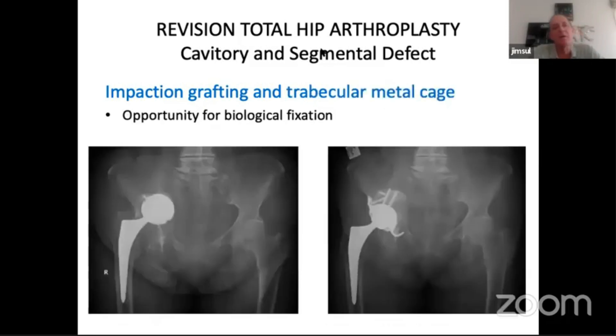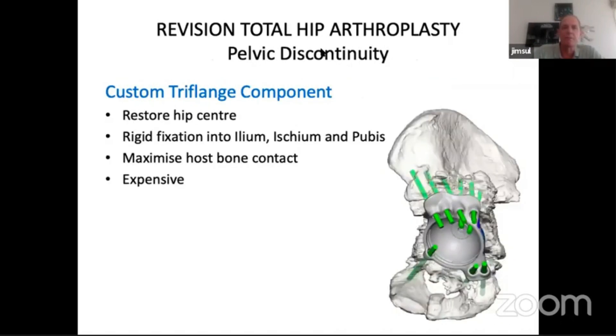This is a recent case — a patient who had an anterior approach total hip and unfortunately the cup was punched right through. In this case we used a biological fixation cage with structural allograft, and the patient, despite the degree of osteopenia, has done well at three years. If you've got pelvic discontinuity, really the best option is to go for a custom tri-flange component. With that you can restore the hip center, get rigid fixation to the ilium, ischium, and pubis, and maximize host bone contact for on-growth. The downside is it's expensive, but in some cases that expense is well balanced by the fact that multiple failures and their accumulated surgeries cancel out any benefit of trying to save money the first time around.